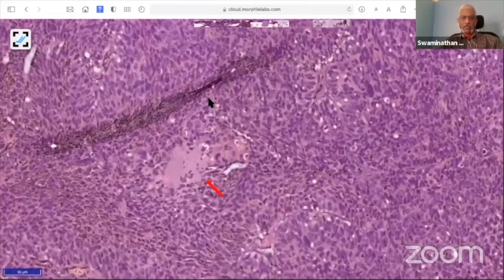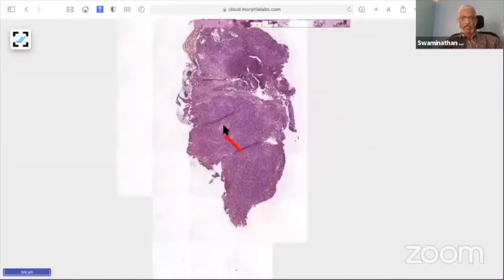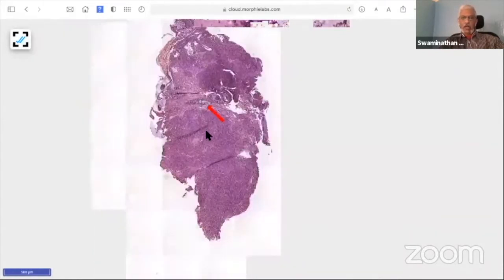When you see blue basaloid cells with peripheral palisading and DCIS comedo type of necrosis, think of basaloid carcinoma. Now the terminology is not used. It's undifferentiated carcinoma in the colorectum, but the comedonecrosis and the peripheral palisading are very, very important because this has a very bad prognosis.